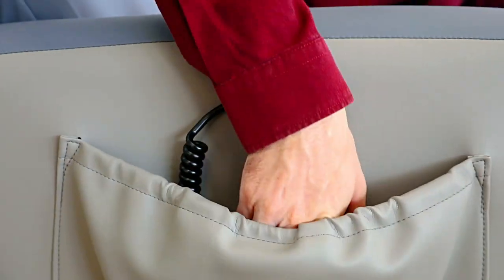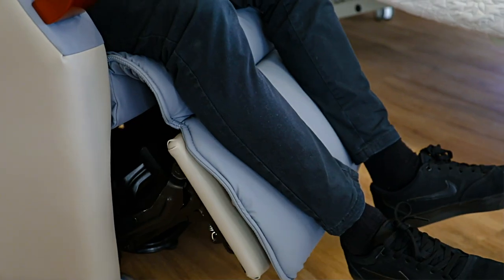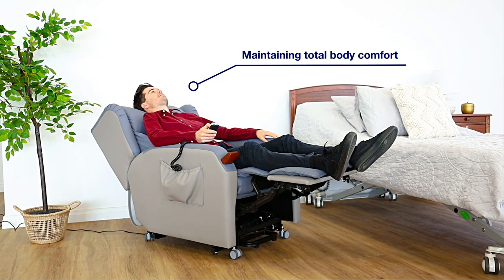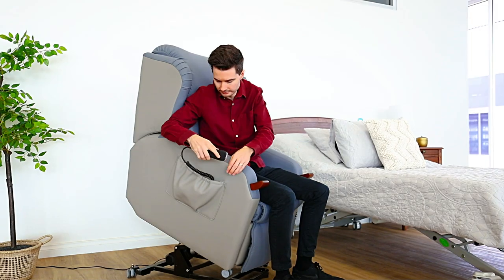You can adjust the leg rest and back rest independently via an easy-to-use remote control, while the twin motor version allows you to recline to a horizontal position while maintaining total body comfort.